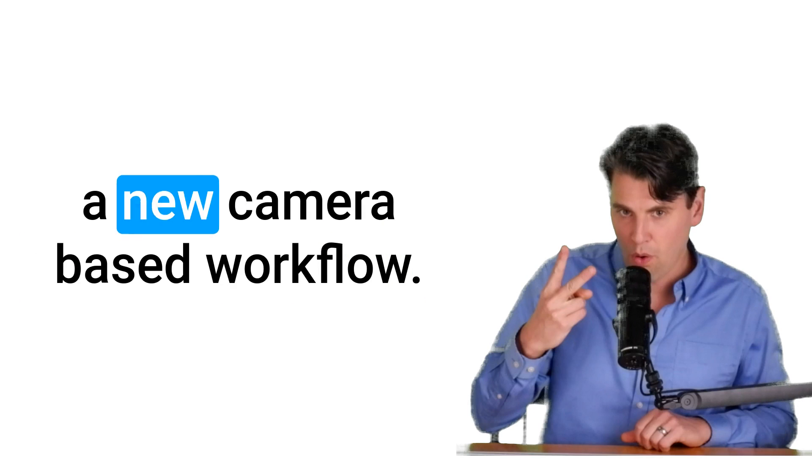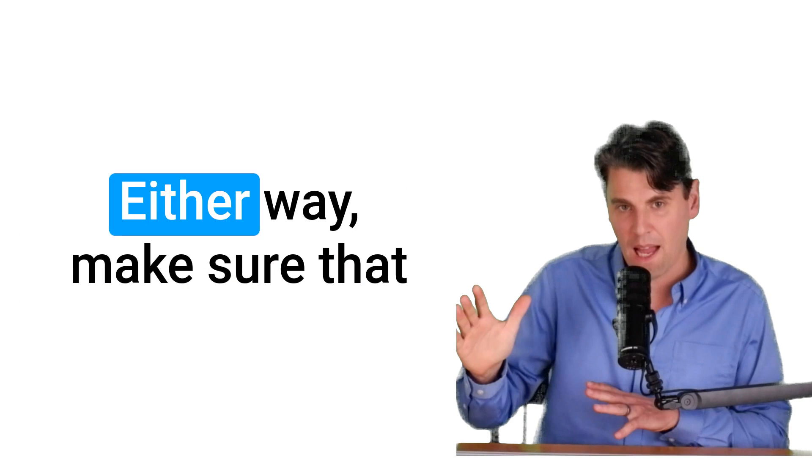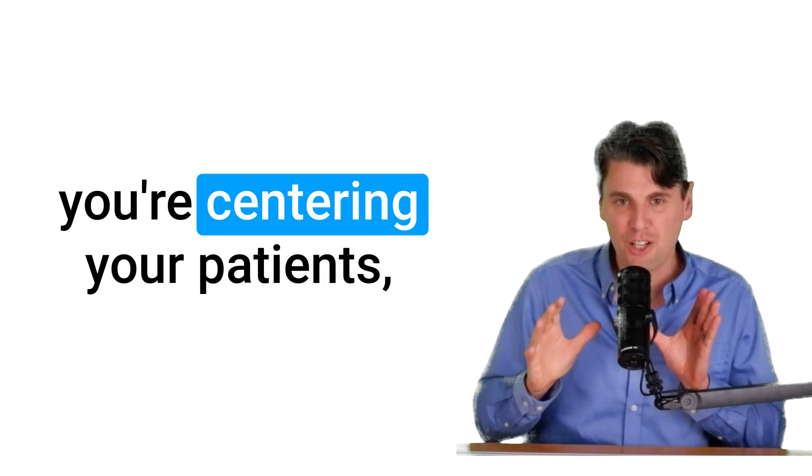So those are your two options, do it from the scout, or do it from a new camera based workflow. Either way, make sure that you're centering your patients.